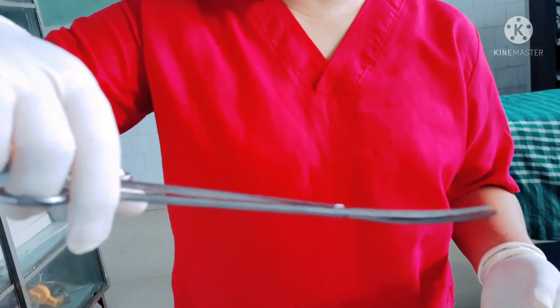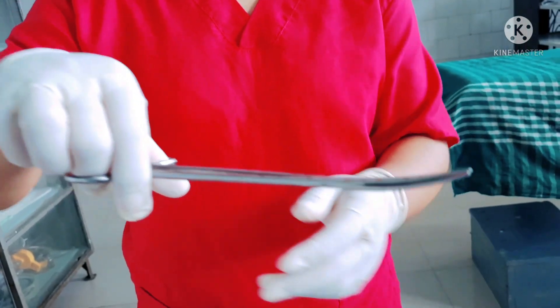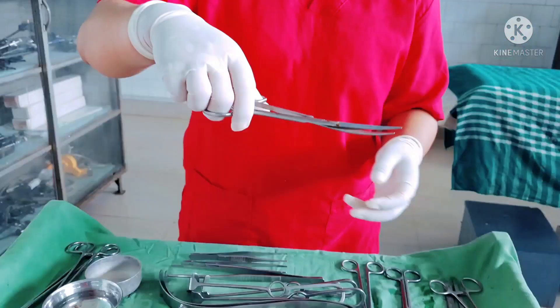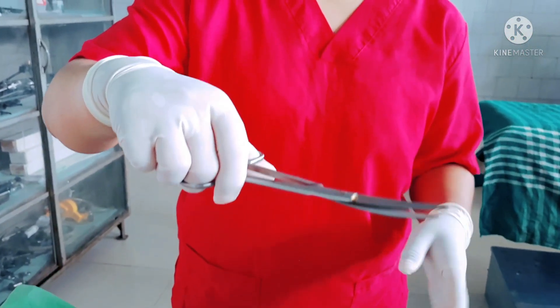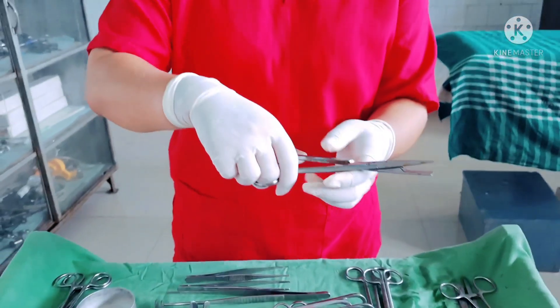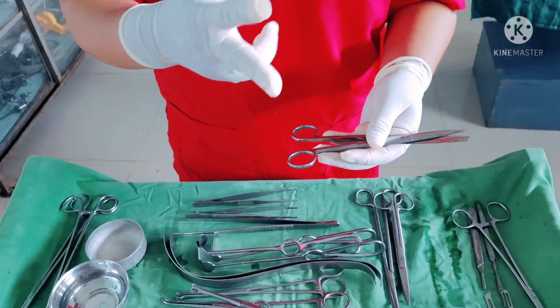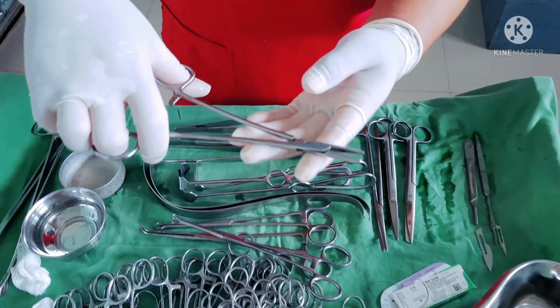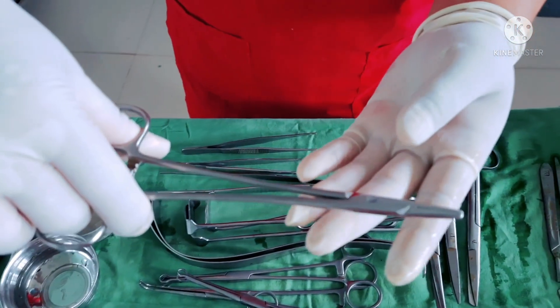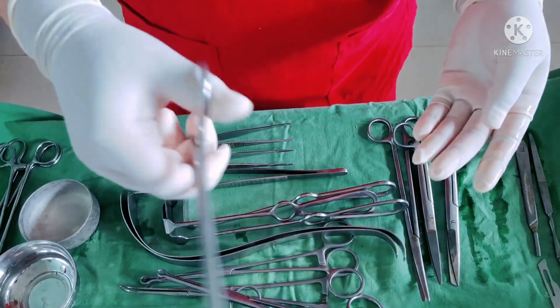Now we have tissue cutting scissors, used for cutting soft tissues — it has a curved end. This is a suture cutter used for cutting only sutures. I have one more scissor for cutting gauze pieces for dressing. Here is Mayo's needle holder, used to hold the needle along with the suture for suturing.